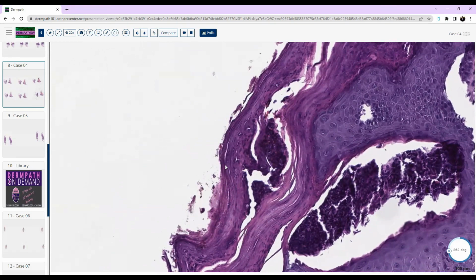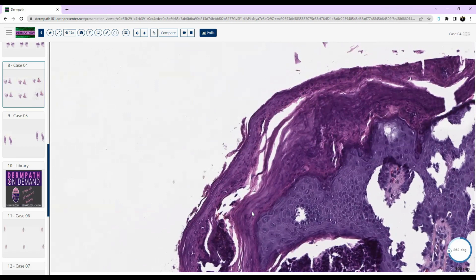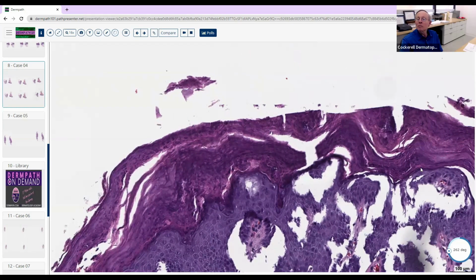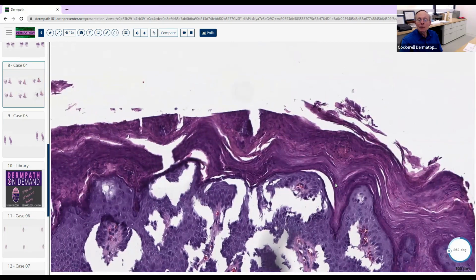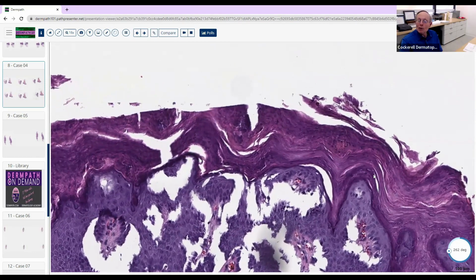Is that hyphae? No, it's not hyphae. But you see that it's also got some eosinophilic characteristics of some of these keratinocytes in the parakeratotic area, and it's got this dark purplish color. We sort of think maybe there's even some dystrophic calcification going on up here. And it's kind of got a granular morphology to it. That ring any bells to anybody?